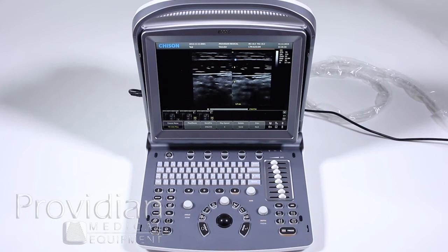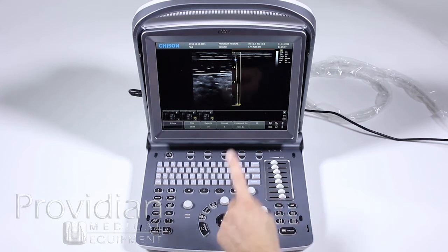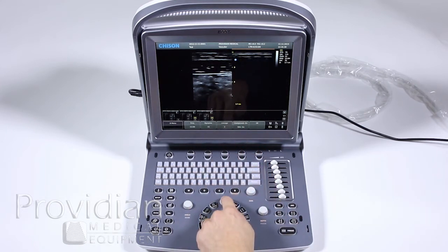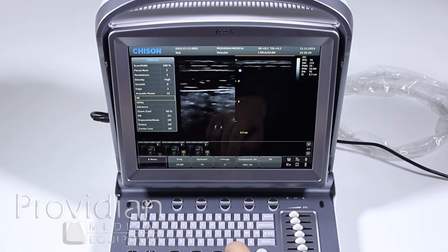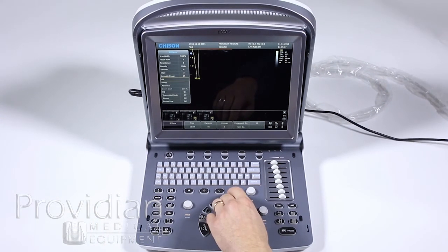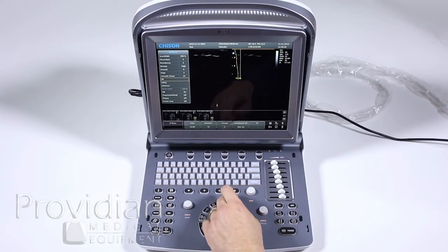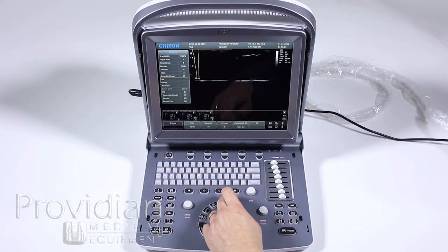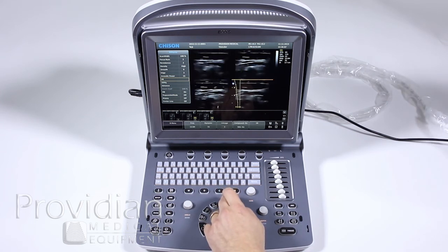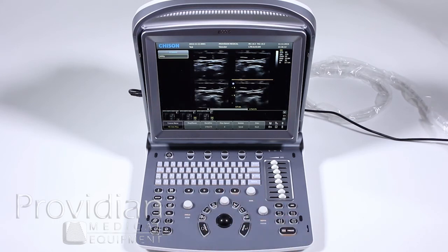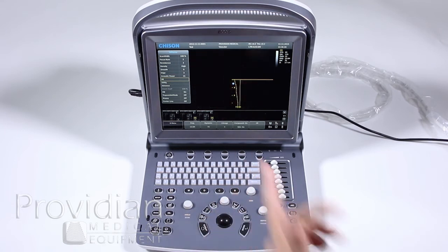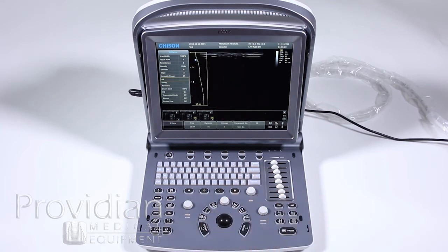If you're doing AFI or something similar, there's a hidden menu. Push down this menu and twist to scroll up to 4B. Go to 4B, then push down and continue scrolling through for each image. When you're done, freeze to get your four images. When you get to measurements, you'll learn how to take measurements on each of those images. Press the B button to go back to standard 2D imaging.